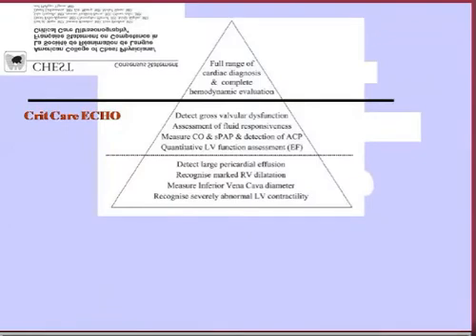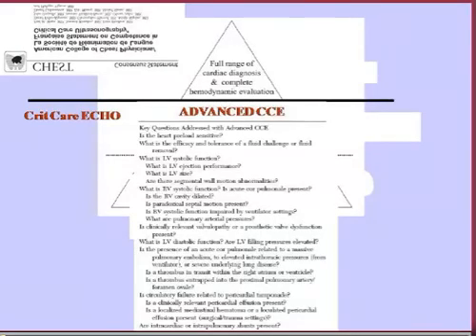You remember that yesterday I told you that there are clearly two different levels regarding critical care echocardiography. A basic level and an advanced level. I think that nobody can see anything on this slide, but just to well differentiate the two levels of critical care echocardiography, two different approaches and two different applications.